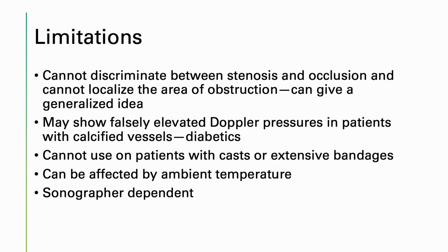It can give falsely elevated Doppler pressures in patients with calcified vessels. Diabetics are typically those patients with calcified vessels. Cannot use on patients with casts or extensive bandages. Can be affected by temperatures. Is sonographer dependent.